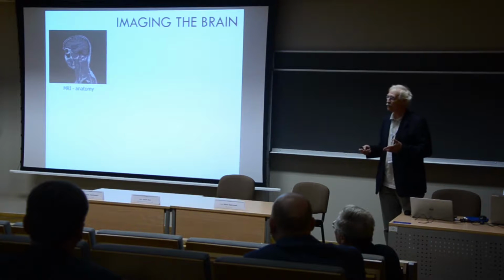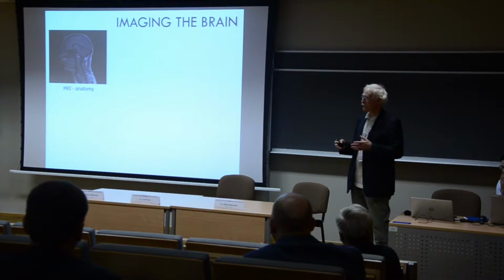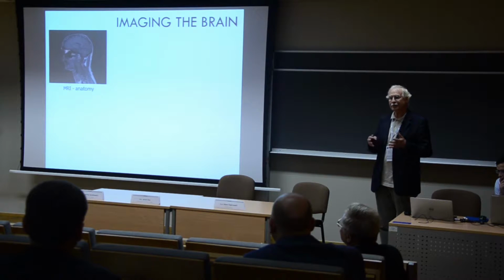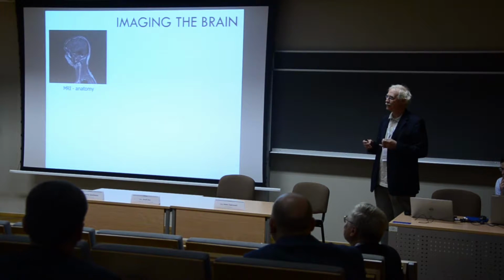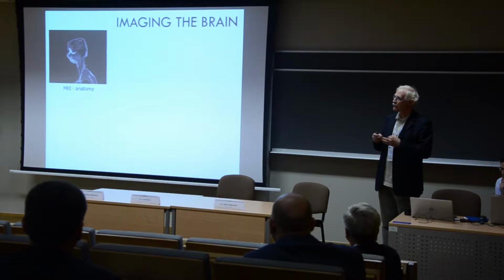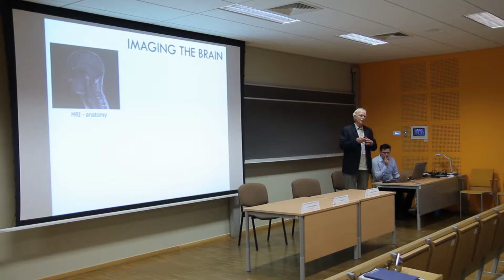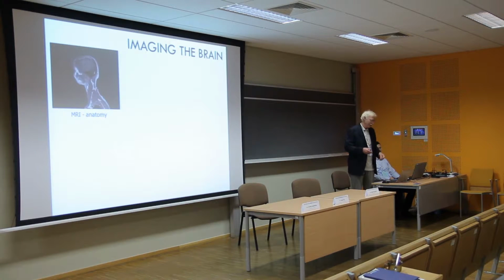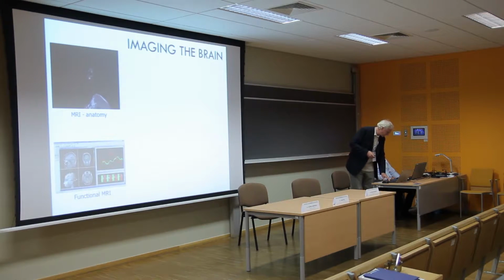And you all know that MRI is very versatile. With MRI, we can measure much more. We have today 26 different physical measurements with MRI. We can measure the flow, we can measure the local pH per pixel, we can measure the local oxygen saturation, we can measure the spectrum, so how much hydrogen, we can measure the flow, lots of things.